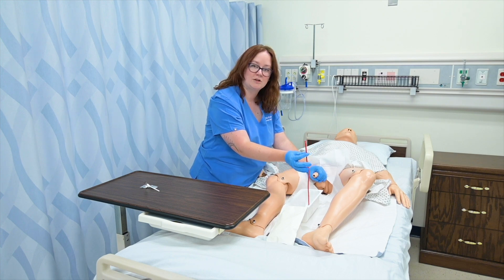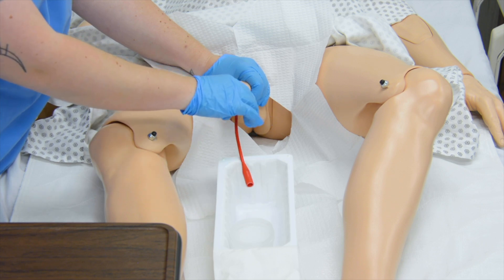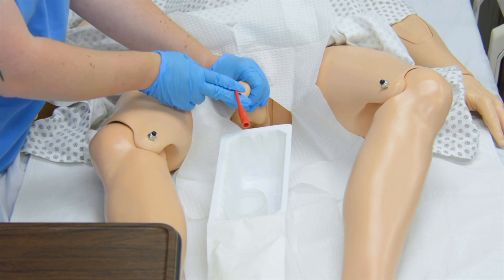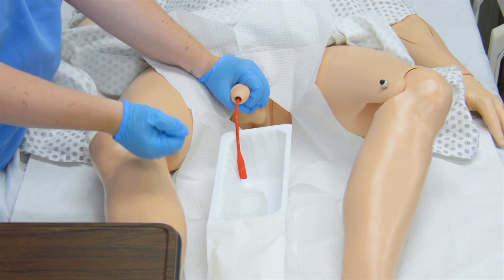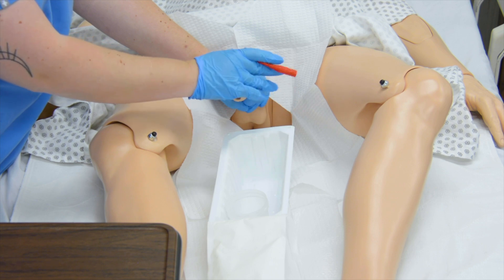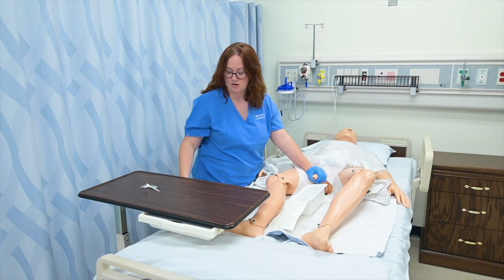With this lubricated catheter tip, I'm going to insert it into my patient's urethra until urine is available. I would watch urine drain from this end of the catheter into the container and simply wait until the urine has completed. Once the urine has ceased flowing, I take this and collect it, withdrawing it out of the penis and discarding of it.